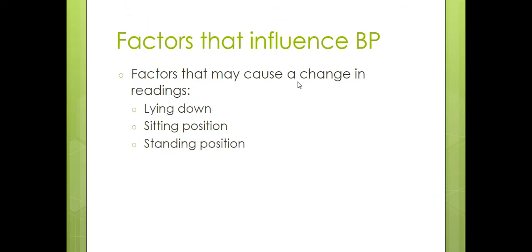Factors that influence blood pressure. These factors may cause a change in the readings. So if the patient is lying down, sitting, or standing. It is very rare that you are going to have a patient stand up to take a blood pressure, but it is something we still teach because some institutions, meaning hospitals, require that it's done, but not very many.